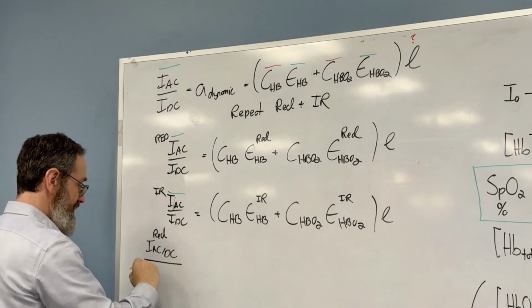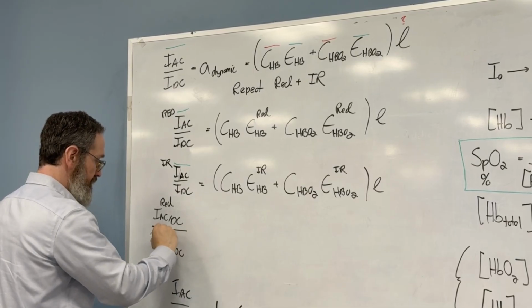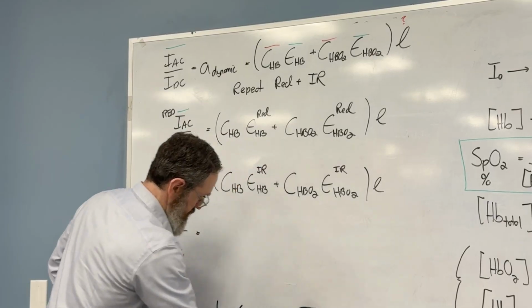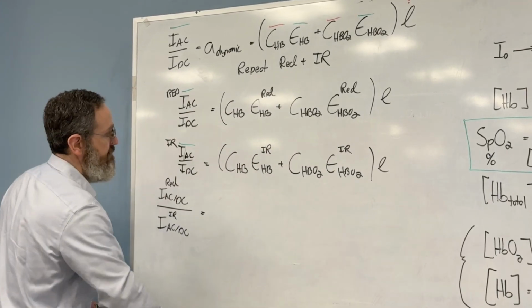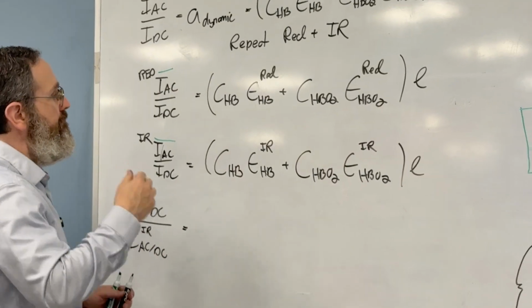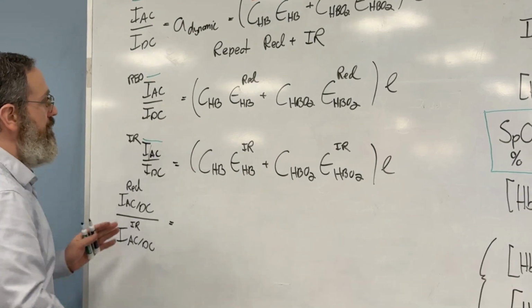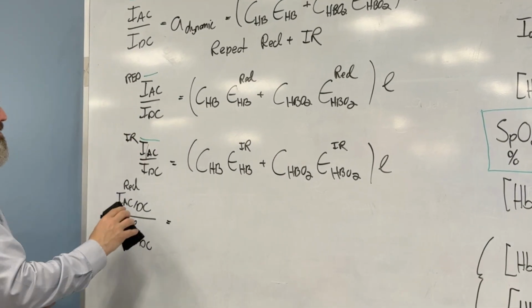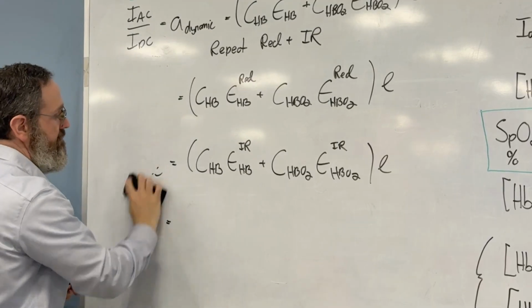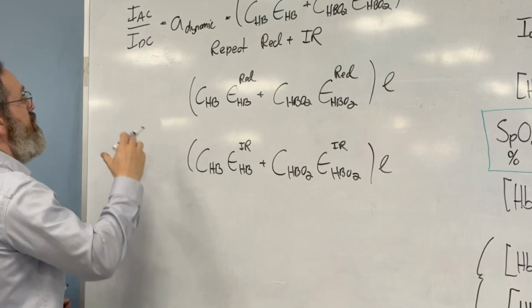And I divide it by I of AC to DC for infrared, I get this equation. I'm just going to rewrite it here.